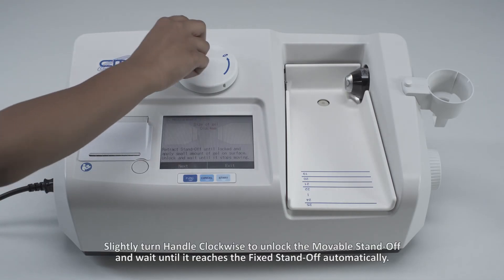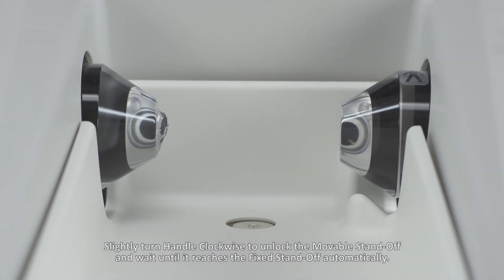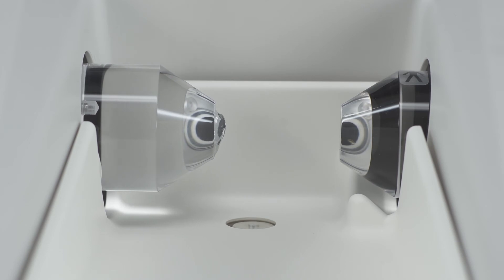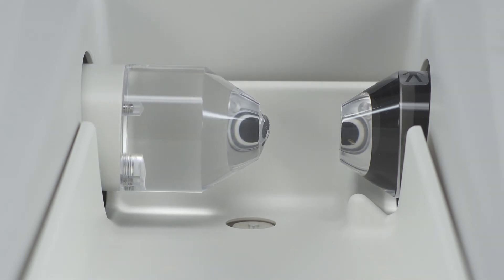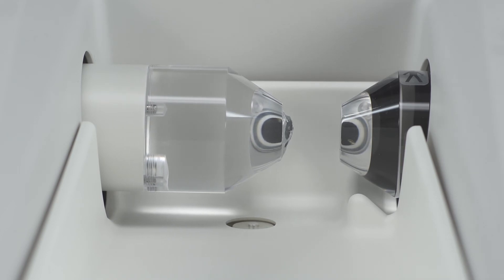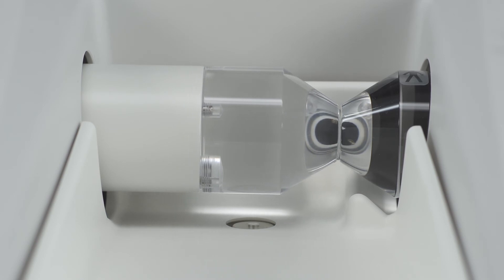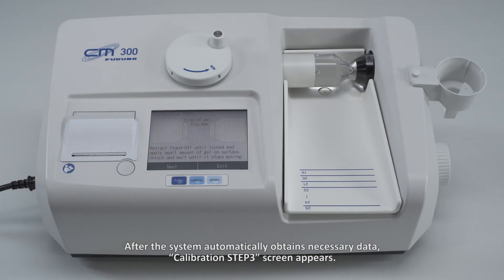Slightly turn the handle clockwise to unlock the movable standoff and wait until it reaches the fixed standoff automatically. Wait about 10 seconds to stabilize the contact between the standoffs and tap Next. After the system automatically obtains necessary data, calibration step 3 screen appears.